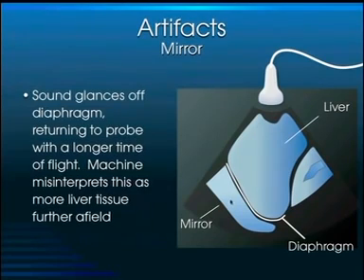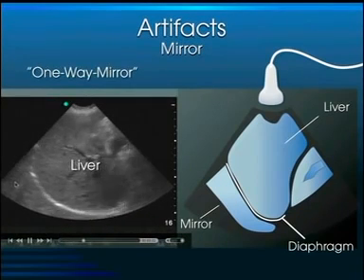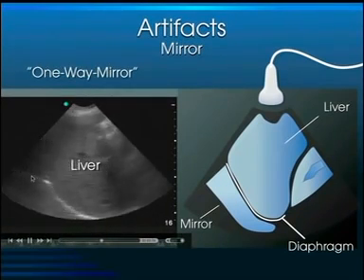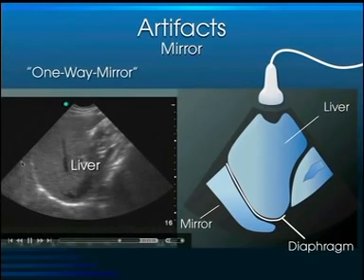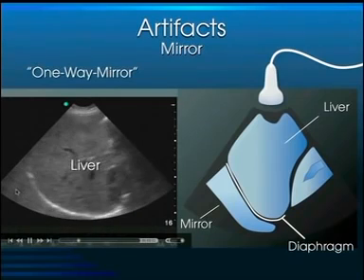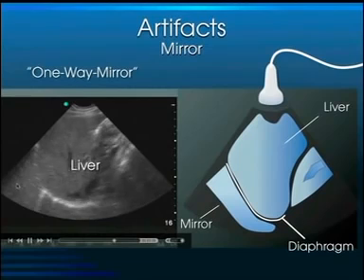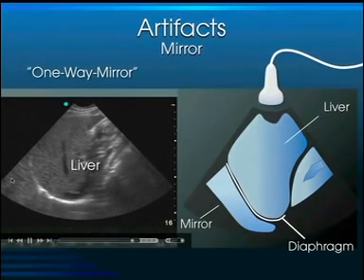And so when you get the mirror image of the liver up in the chest, or on the left side of the body, the spleen up in the chest, that's called the mirror image artifact. And it's an expected artifact in all normal individuals. We can see it here. This is the liver. Here's our diaphragm here. And superior to the diaphragm, we see the liver up here superiorly. Remember, this is a coronal plane, so structures over here are more towards the head, or more superior.